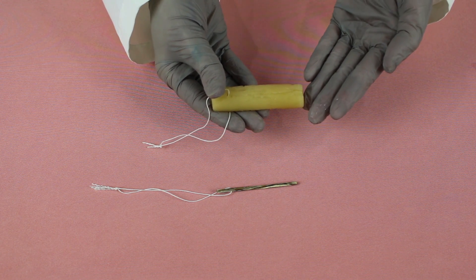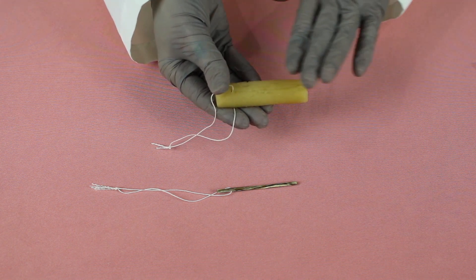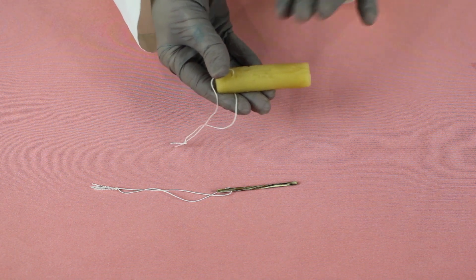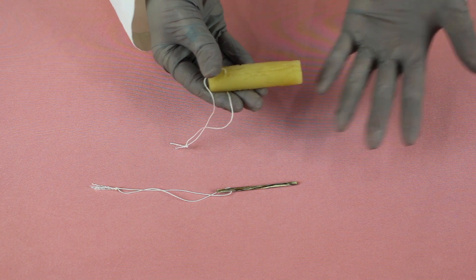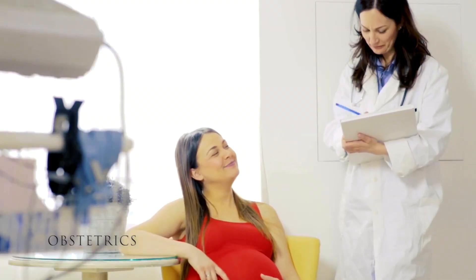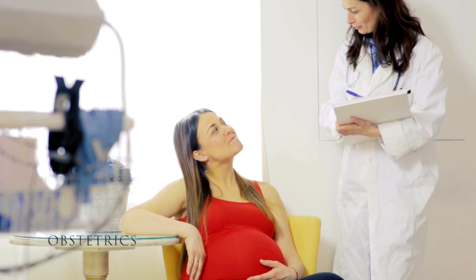While synthetic versions may swell up faster, they are not guaranteed to provide the full, even dilation of Medgyne's all-natural Laminaria. It's more comfortable for patients and increases efficiency by reducing the need for manual dilation. Laminaria minimizes the patient's time in the clinic.